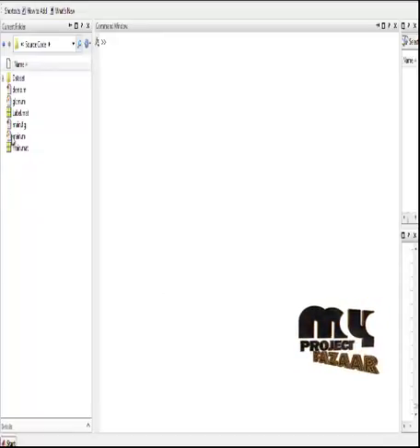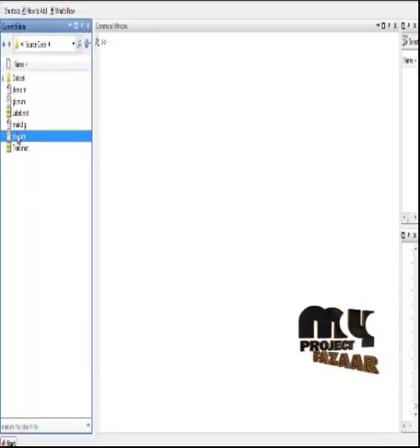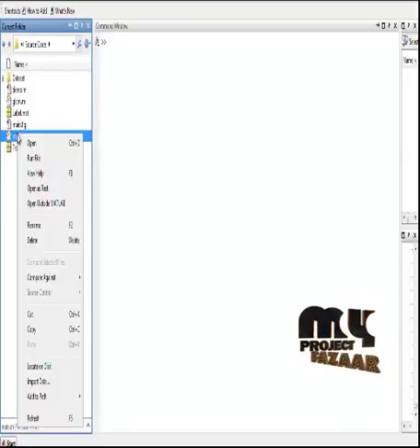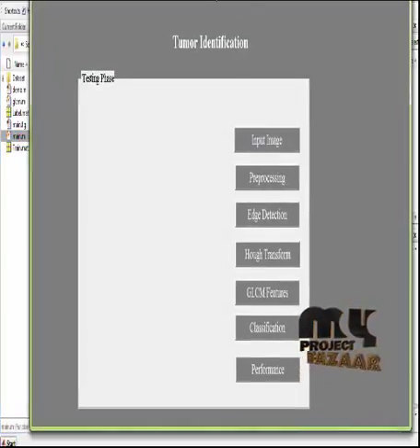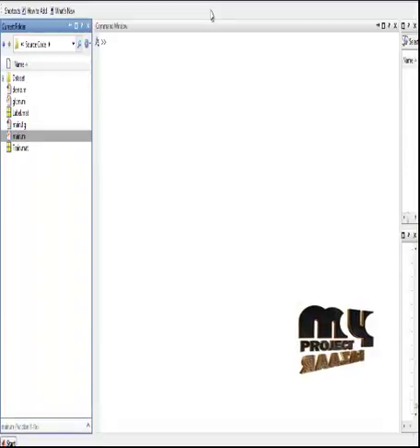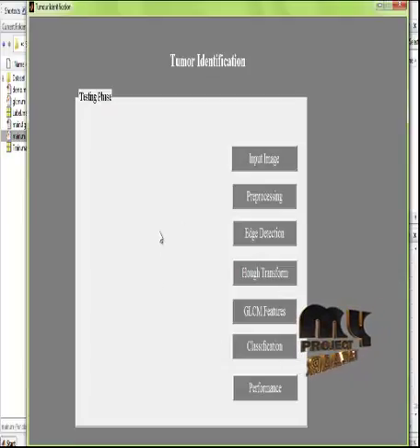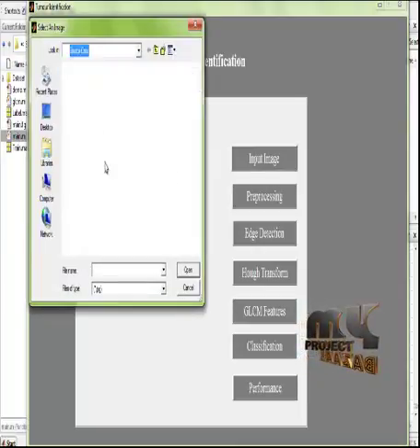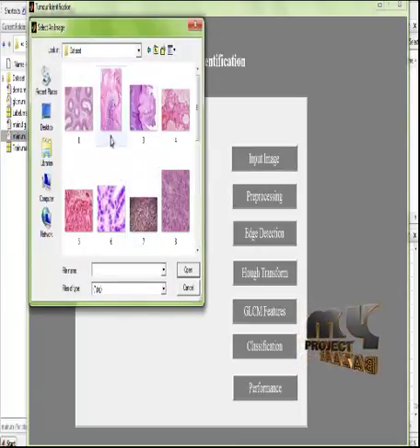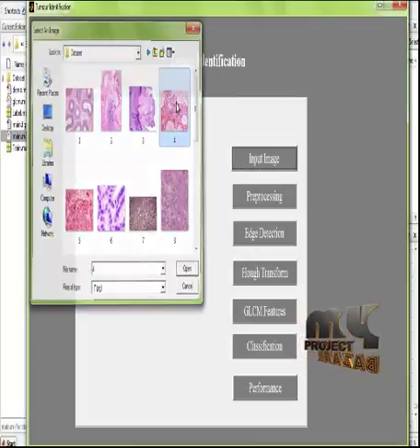Let us look at the running procedure. To run the code, select the file main.m located in the source code folder, right-click it, and click on run file. You will get the user interface for the execution of the process. The user interface contains display areas and buttons for running the process. We then select any one of the input images present in the dataset.